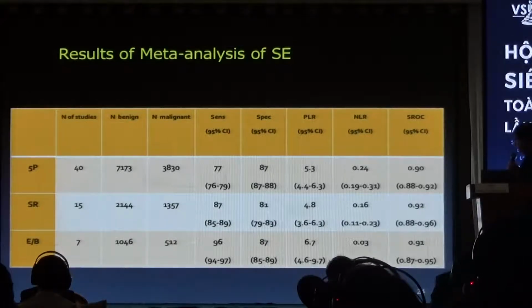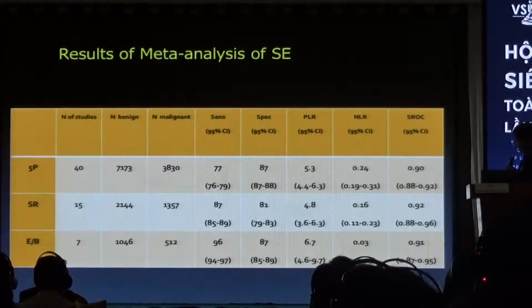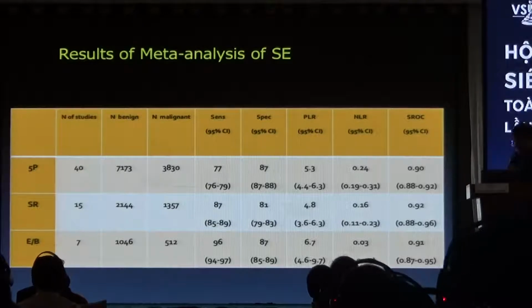And you can see that the E to B mode ratio is 0.03. And what that means is if you have a negative test, you can downgrade lesions. If you did this mathematically, we could downgrade a lesion that based on BI-RADS had a probability of 50% of being malignant and drop that down to 2%. So we could downgrade even 4Bs using this technique. So this is a very important number, and we should have that out in press shortly.